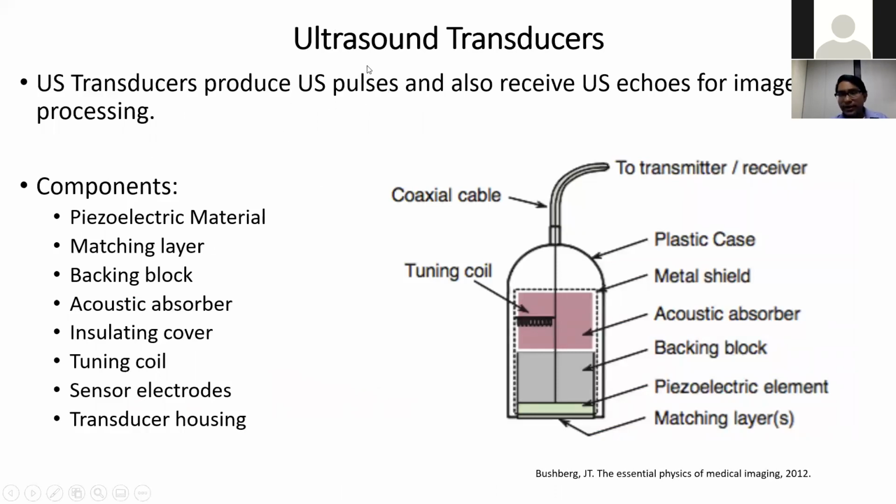So I'm going to talk next about ultrasound transducers. Here on the right, you can see an image of an ultrasound transducer. The role of a transducer is to both transmit and receive echoes for image processing.